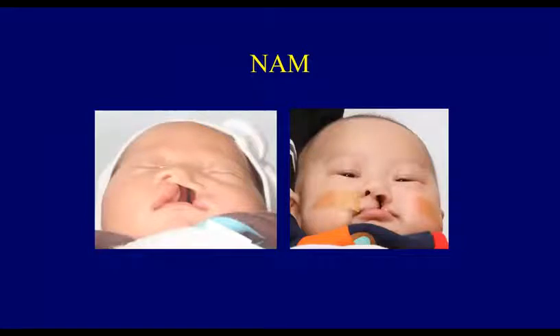Now, I think NAM is important for complete cleft lip, where the alveolus is widely separated. You can see in this case the before and after NAM, the nasal morphology has become better, and also the alveolar segments are closer to each other. So when we repair the nose, the nasal floor, certainly we have less difficulty in the reconstruction of the nasal floor. So if you have NAM, that's good. If you do not have a NAM service, you can also do something else, such as taping or a change of the lip position in order to bring the alveolar segments closer together.